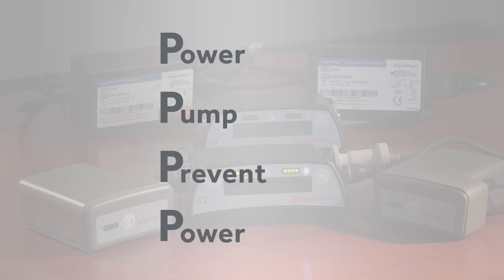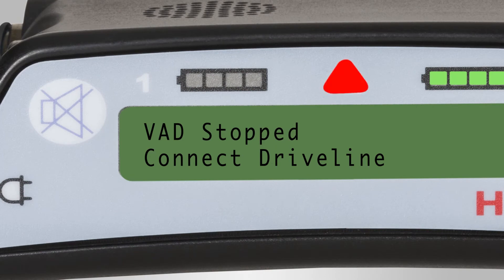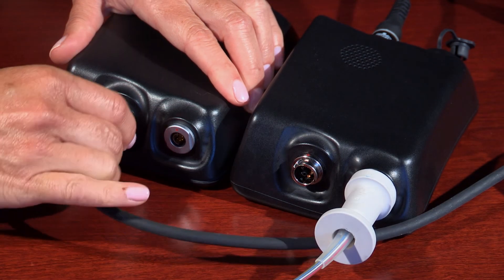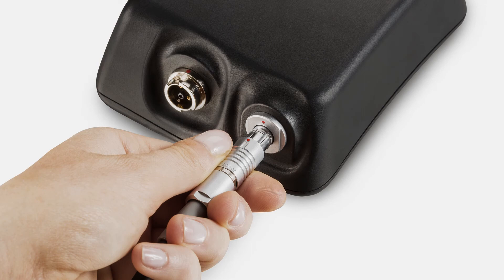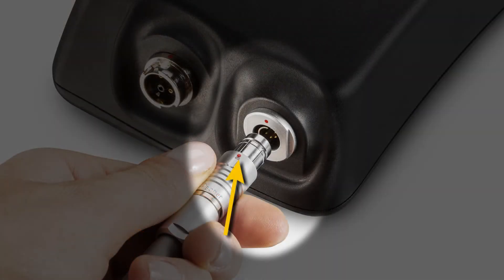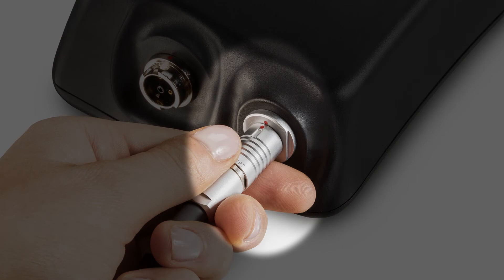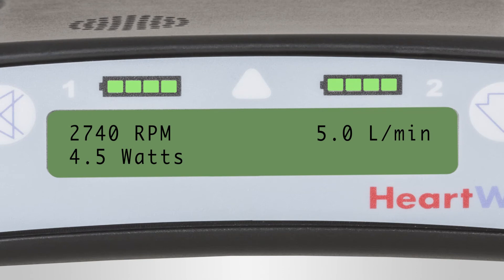The first P is for Power: connect one power source to the new controller. A VAD stopped alarm will start — this is expected and will end once the pump driveline is connected. Restarting the pump is the priority, so don't worry about silencing the alarm until after getting the pump restarted. The second P is for Pump: pull back the white driveline cover to expose the silver connector. Disconnect the driveline from the original controller by pulling the silver connector away — do not pull on the driveline cable. Connect the driveline to the new controller by aligning the two red marks and pushing together. The pump should restart. Verify the pump is working by checking the controller display for speed in RPMs, flow in liters per minute, and power in watts.